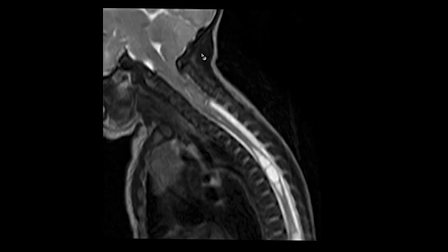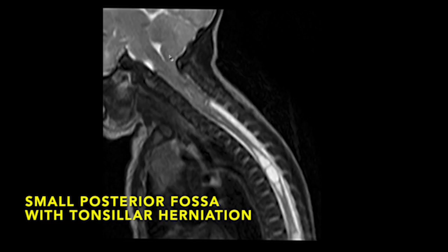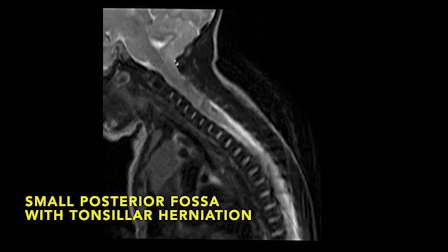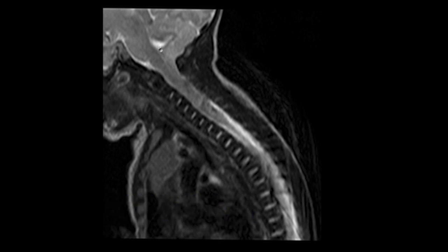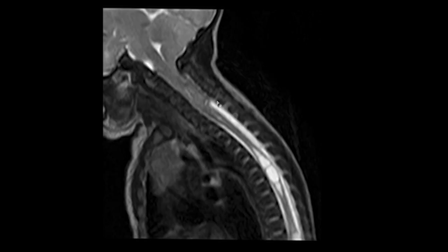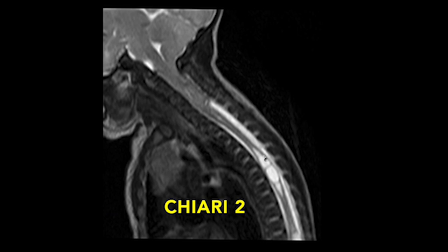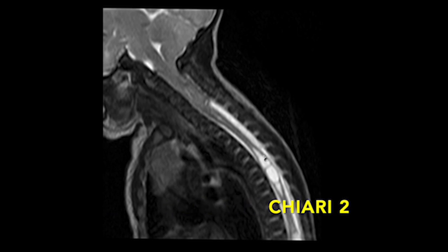On the sagittal brain series, you can clearly appreciate a small posterior fossa with tonsillar herniation and a low-lying fourth ventricle. All these features are suggestive of Chiari 2 malformation.